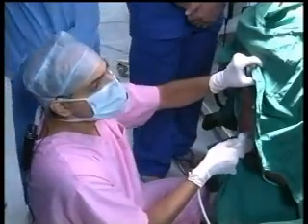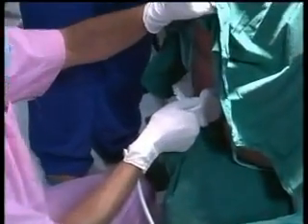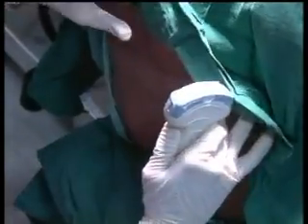Okay, when you do the lumbar anatomy, you start by identifying the structures from down. So the first structure you find is the sacrum, which will be like a continuous line. Show us the morphology first, and then we can get a sono picture of where you are now, anatomically. Okay, you are at the bottom of the spine.